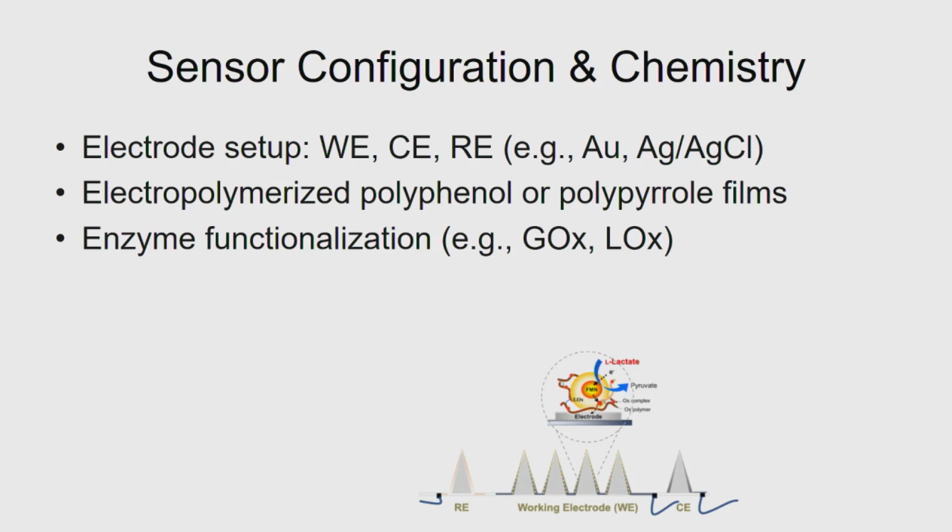Just to show you, everything is very conformal and nothing is sticking out and nothing can be delaminated when you push it into the skin, because the process of insertion into the skin is mechanical, you're applying forces there, you're applying 10 newtons there. If there's going to be any deformity there, you can easily delaminate the layer, you can easily rip off the layer, and if the microneedles are not functionalized, how are you going to measure things?